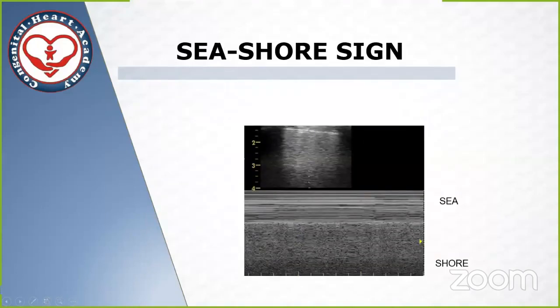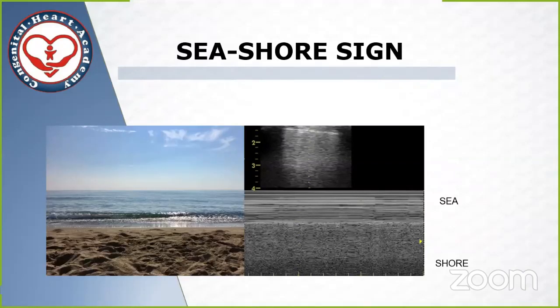If we apply M mode to a normal lung, we'll see the common seashore sign, the described seashore sign.